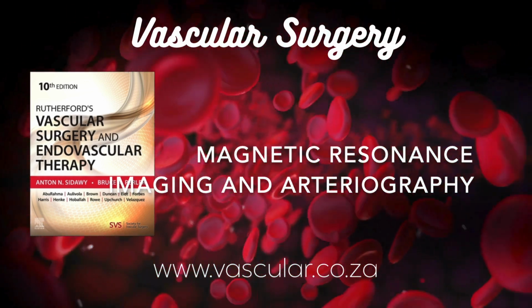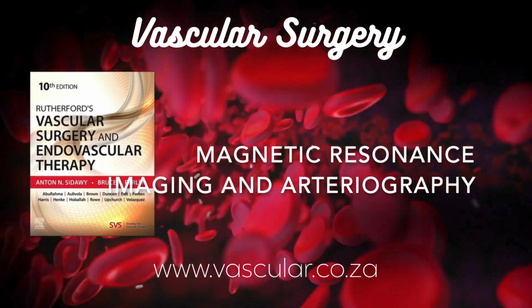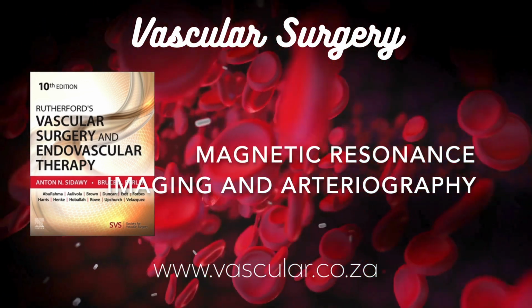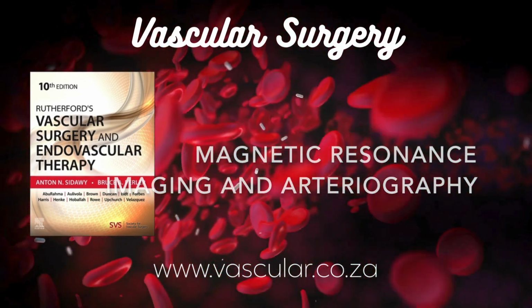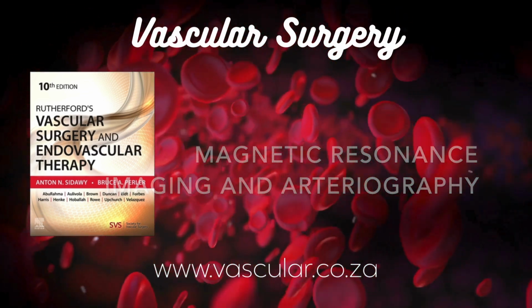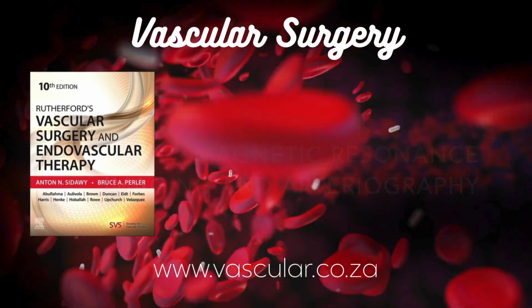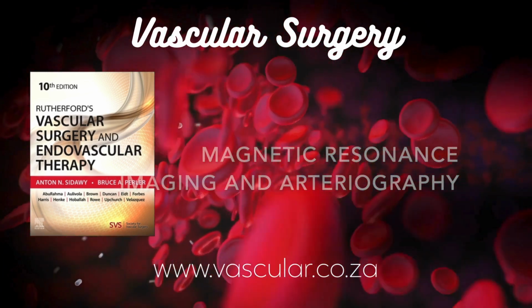A pulse sequence is basically the recipe, the set of instructions we feed into the MRI machine for a specific scan. It defines the exact timing and combination of those RF pulses and the magnetic field gradients we talked about. Changing the sequence changes the type of image we get, its contrast, and how sensitive it is to different things. And the book mentioned spin echo and gradient echo.